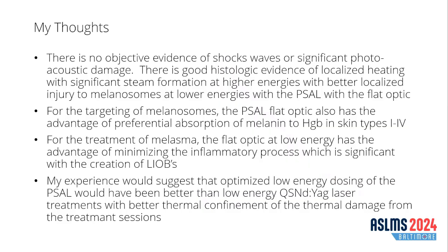So, the lesson here, look, there are no shock waves. I keep hearing this nonsense about shock waves and significant photoacoustic damage. There isn't. There's local heating. This is what picosecond devices do well. They locally heat the area, and again, when you use a flat optic, you can localize the energy to the melanosomes and damage them. The flat optic with the picosecond alexandrite also has a preferential absorption of melanin over hemoglobin.